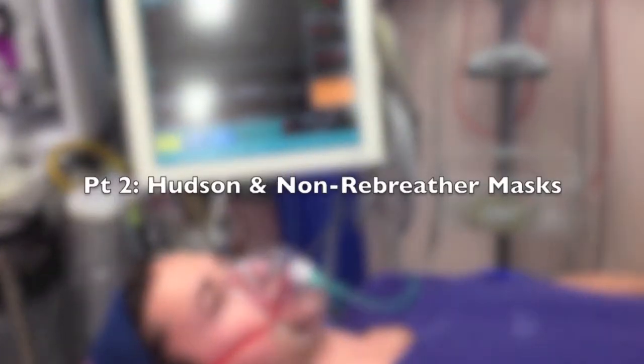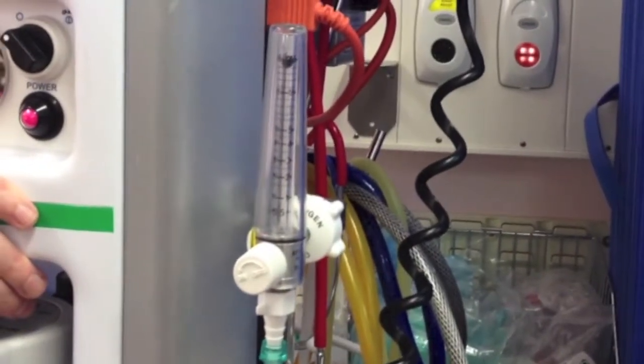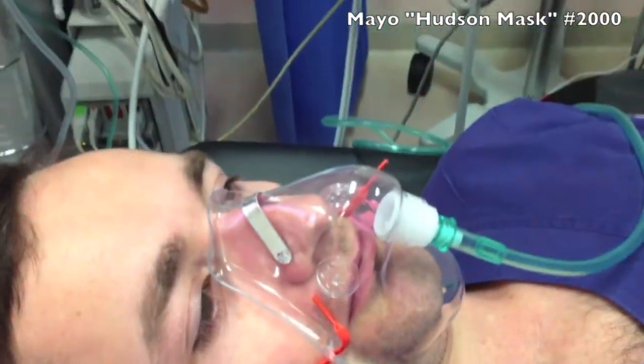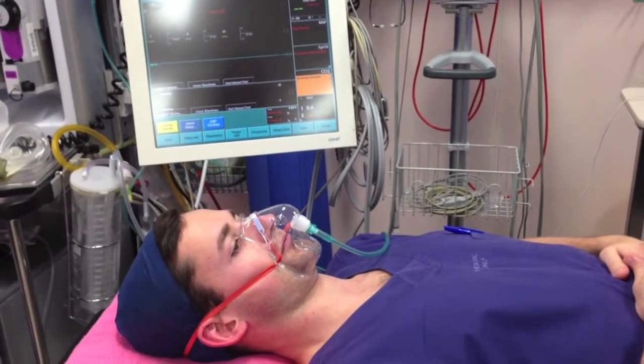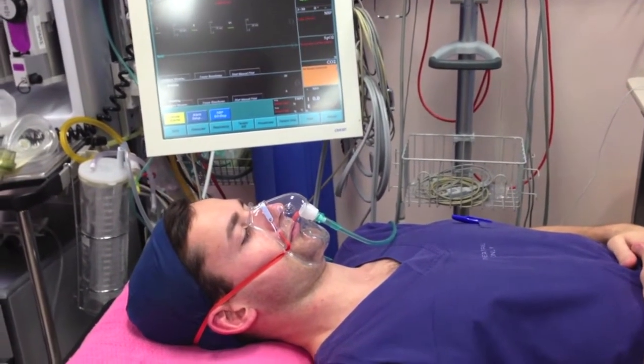When using a standard Hudson mask during normal tidal ventilation, the flow rates with inspiration may be much higher than the 15 litres per minute of fresh oxygen flow being delivered by the oxygen tubing. This leads to entrainment of room air through the ventilation ports and around the edges of the mask, which dilutes the inspired oxygen concentration.